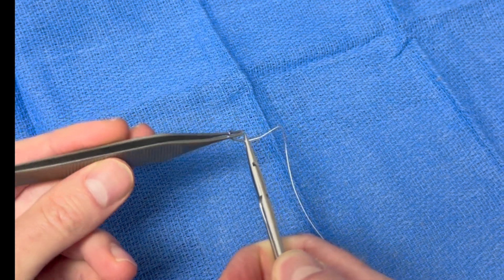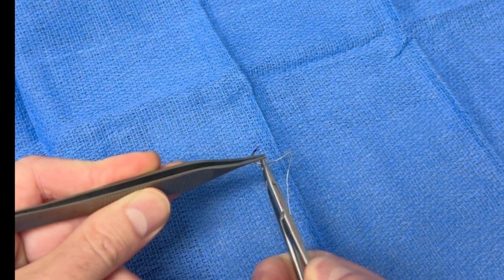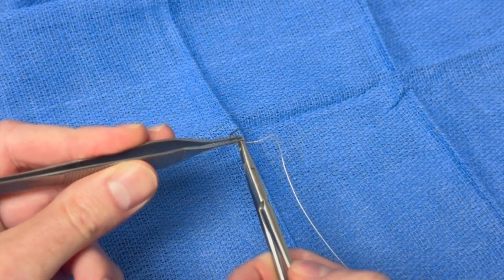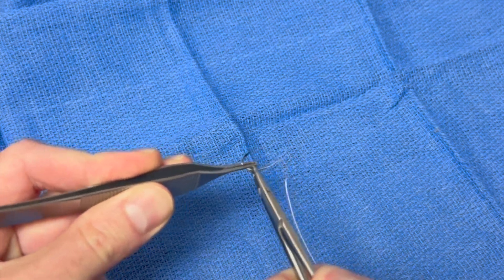In this example, you can see how the smooth area on this non-platformed Adson forceps does not securely hold the needle and the needle slides. In contrast, this is a platformed Adson forceps, so when you're suturing it holds the needle and prevents it from sliding, which gives much greater control.